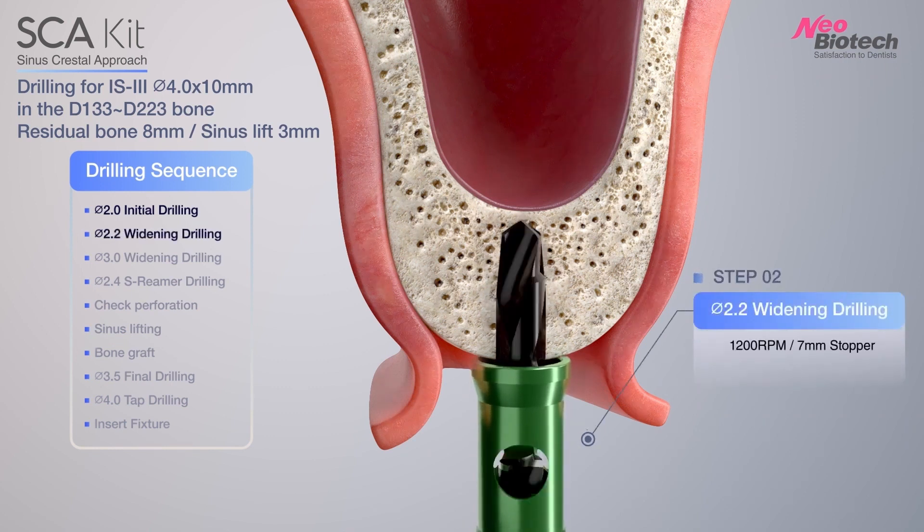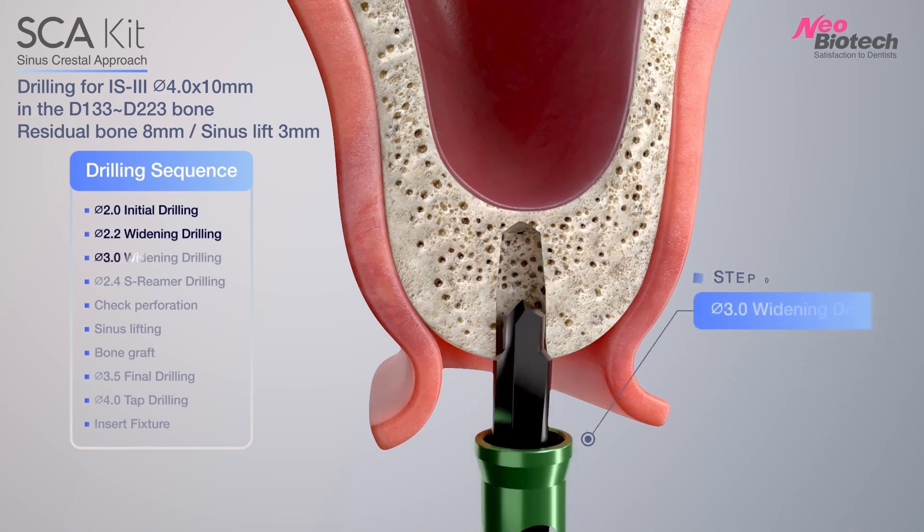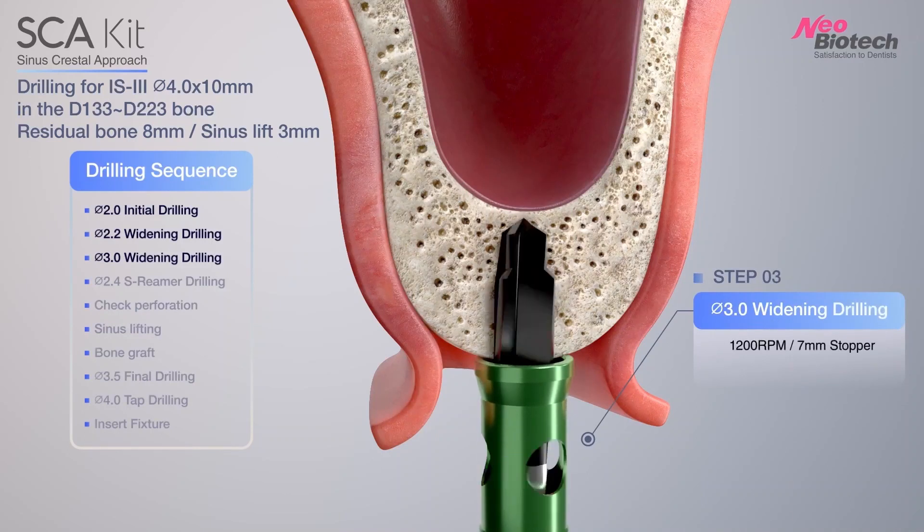Using 2.2 drill with stopper in surgical kit, widening the hole. Then using 3.0 drill with stopper in surgical kit, widening more.